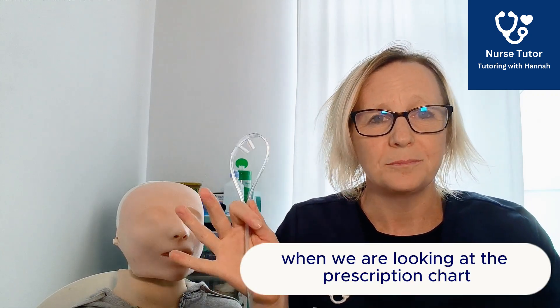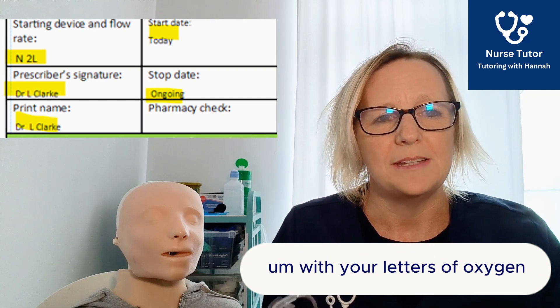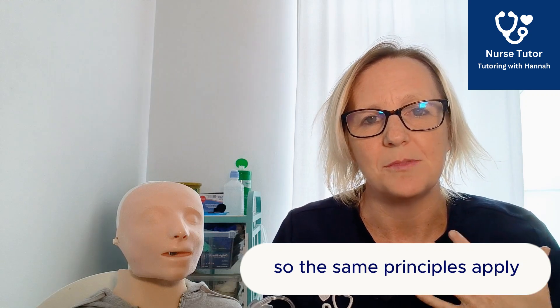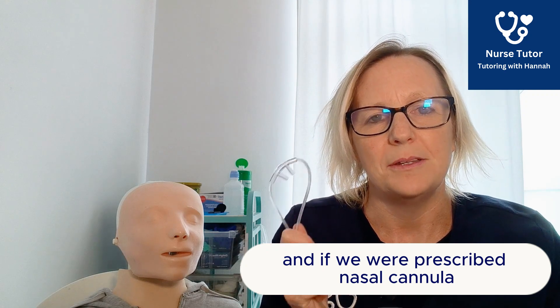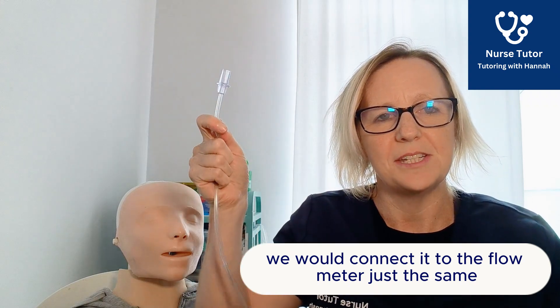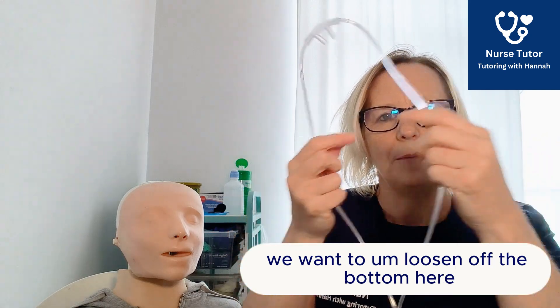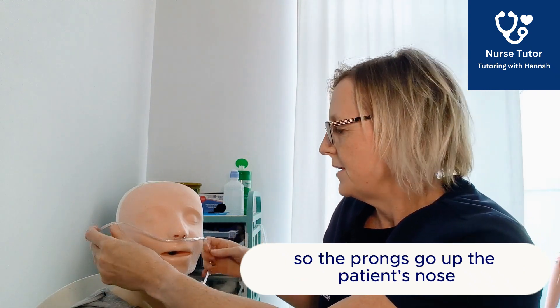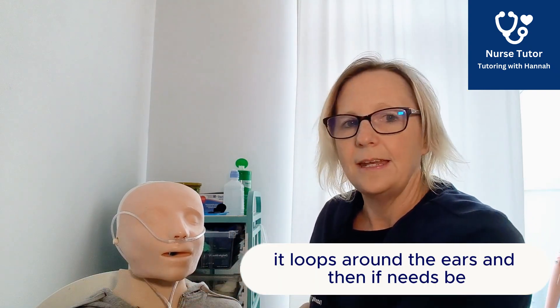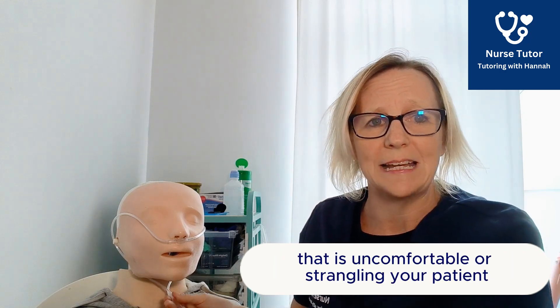When looking at the prescription chart, it would be prescribed with an N and your litres of oxygen. The same principles apply in terms of reading the prescription chart and confirming it's valid. If prescribed nasal cannula, we would need to select this piece of equipment. We would connect it to the flow meter just the same. It shouldn't be prescribed over four litres, so just check that's correct. We want to loosen up the bottom and apply it onto the patient so the prongs go up the patient's nose.